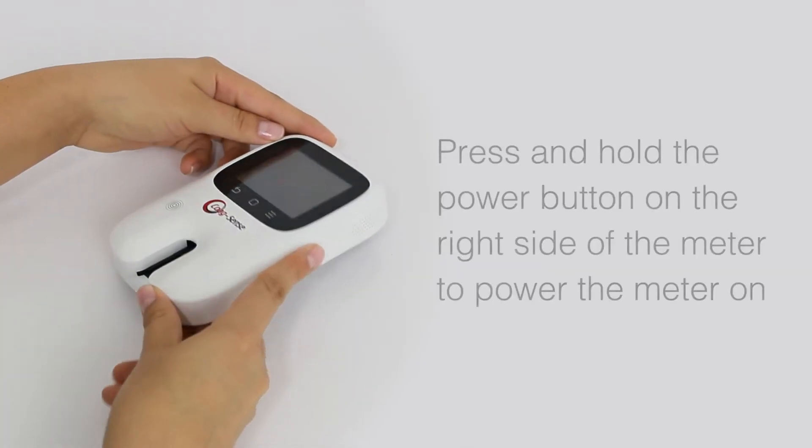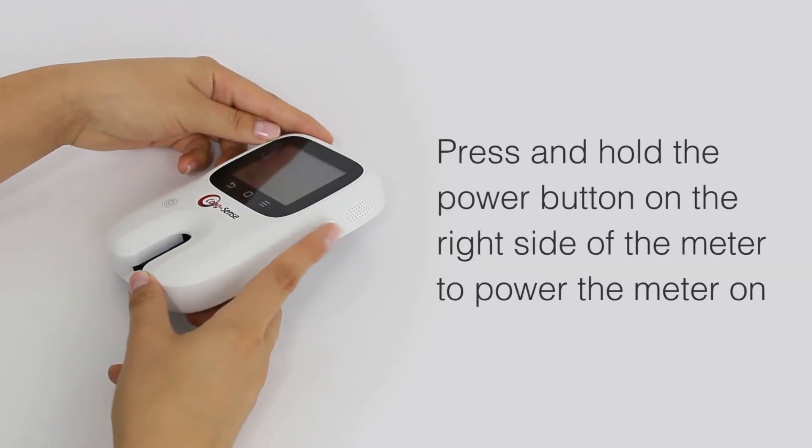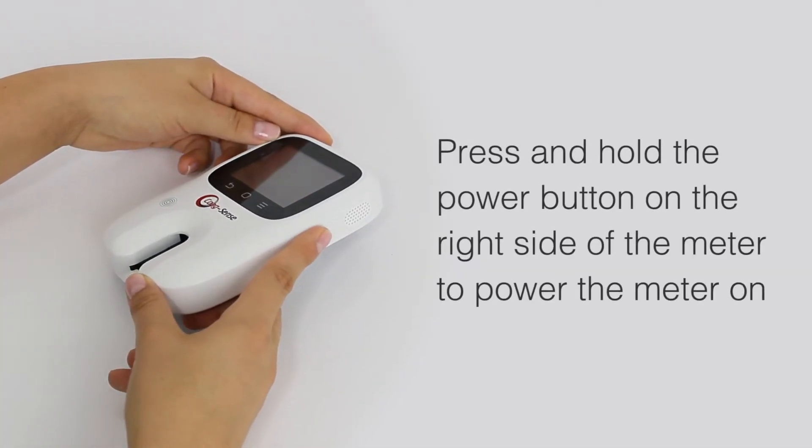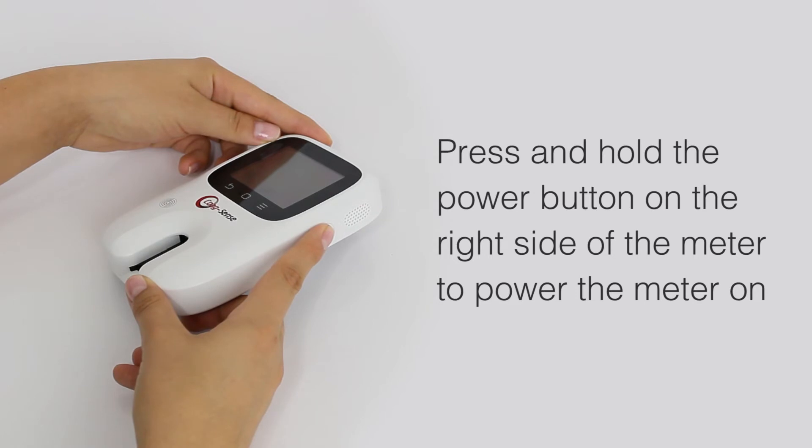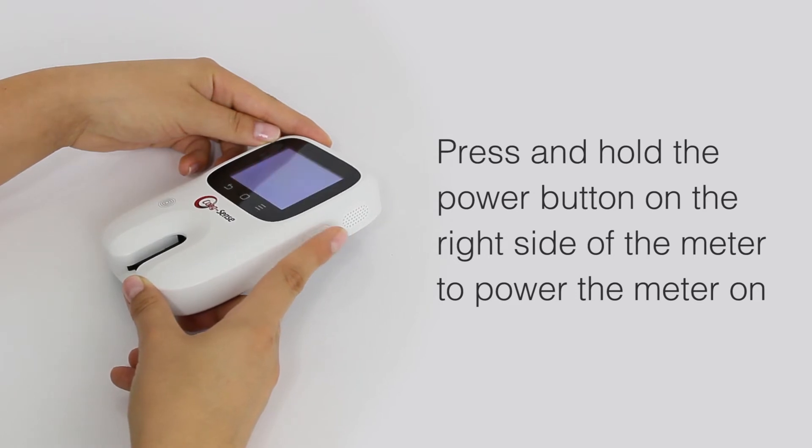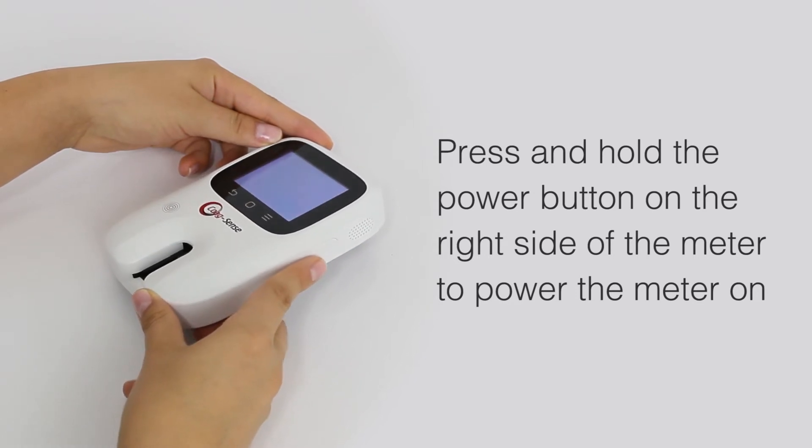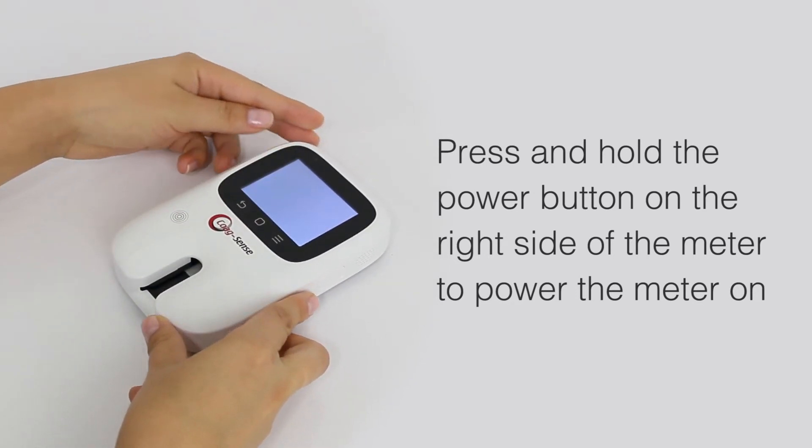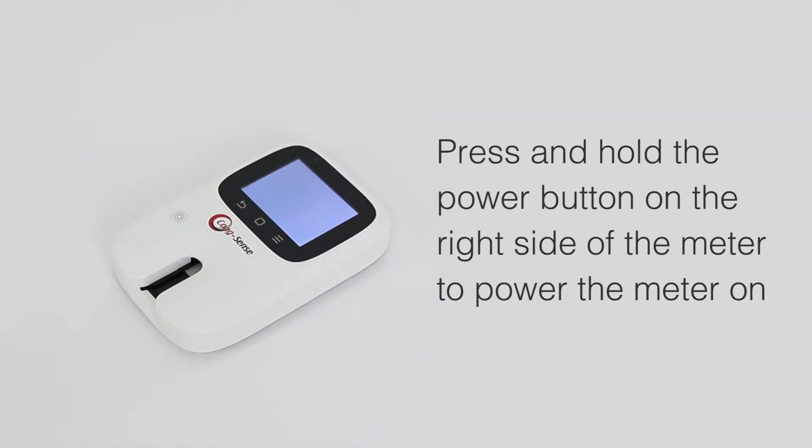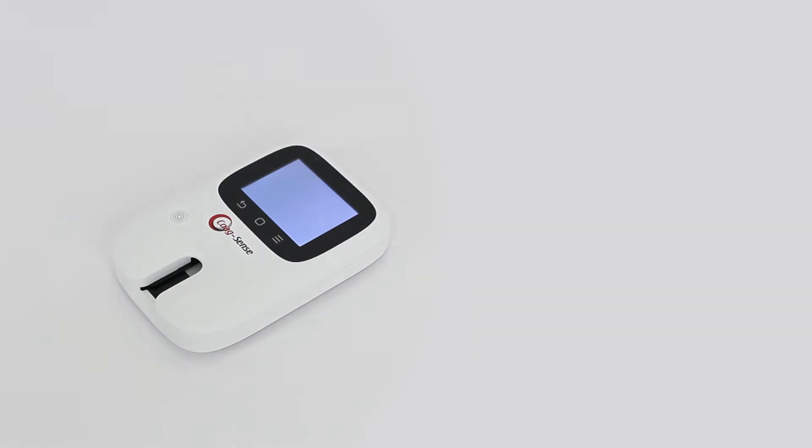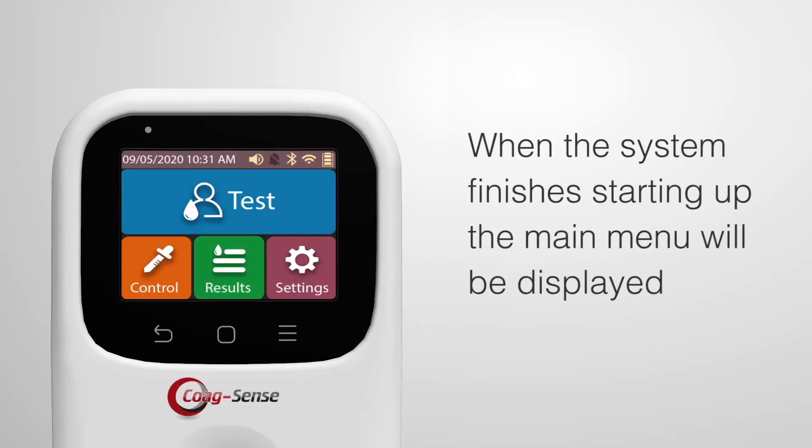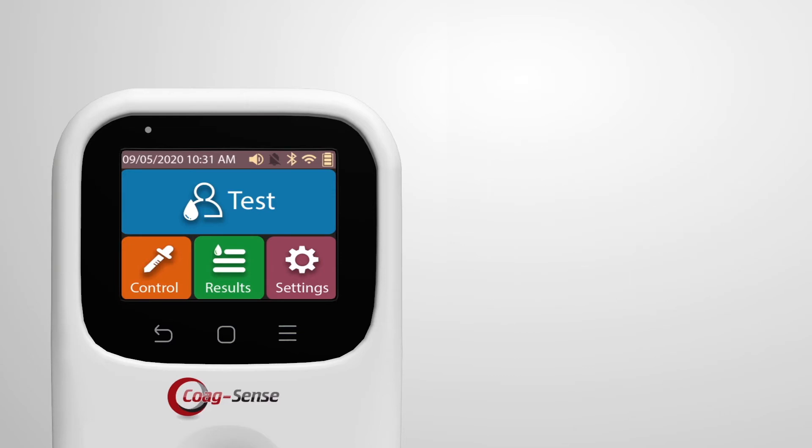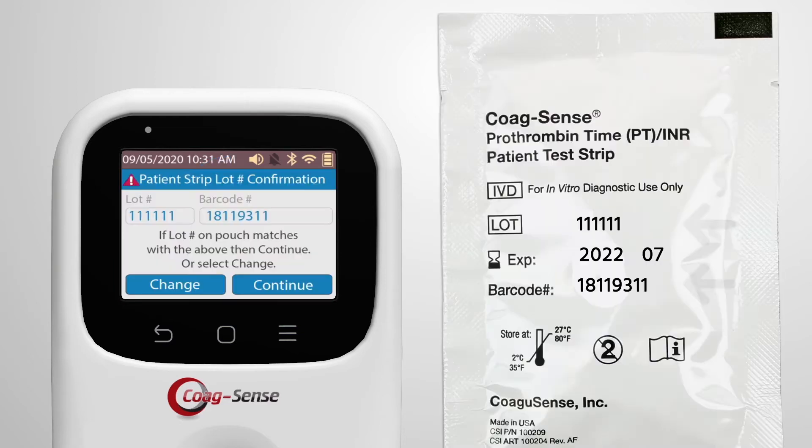Press and hold the power button on the right side of the meter to power the meter on. Place the meter on a stationary, level surface for testing. When the system finishes starting up, the main menu will be displayed. Press the test button.